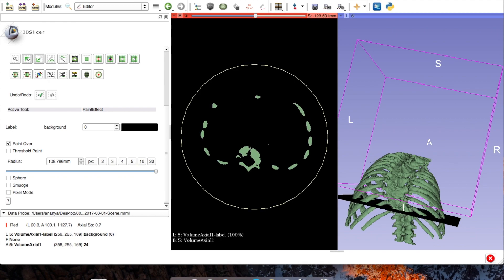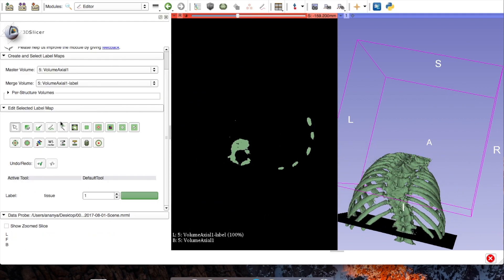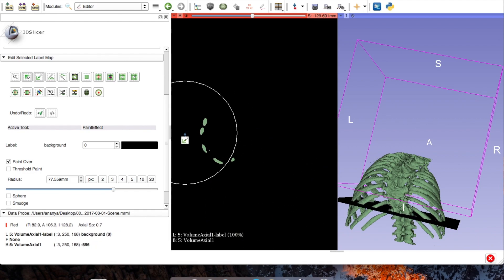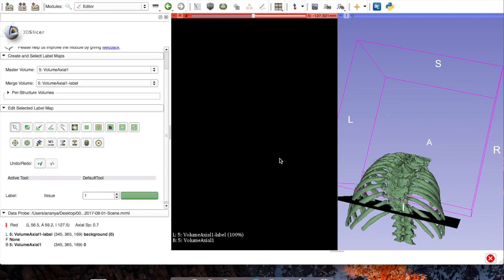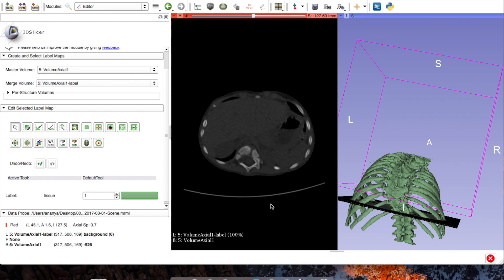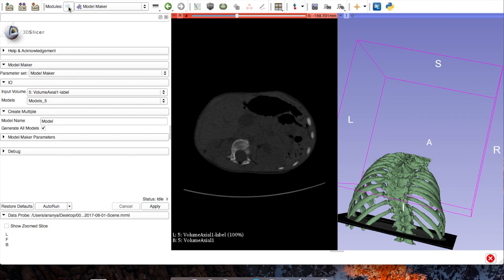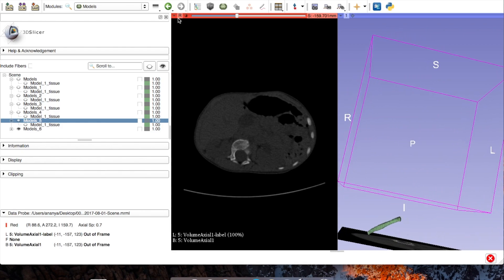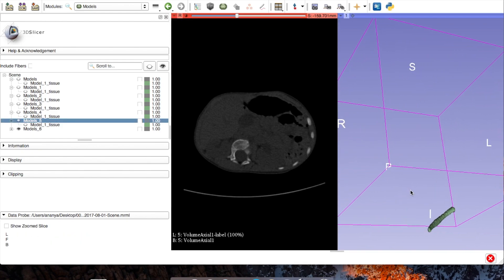On each slice, delete the right side, the left side, and everything that's not that one rib. This does take some practice but goes fairly quickly. Make sure you haven't missed anything going through the scan, then create a new model. You can also change the color contrast — I like to keep it in black so it's easier to see any extraneous matter. Create the new model using Model Maker, and that's what the isolated rib will look like. Some will be more curved, some longer, but that's the general idea.